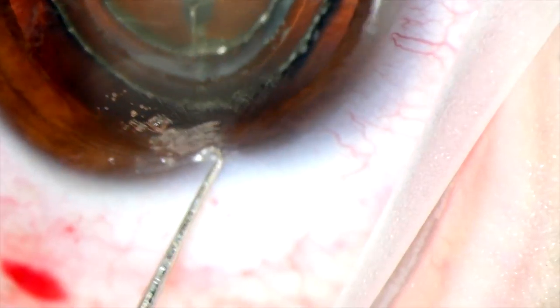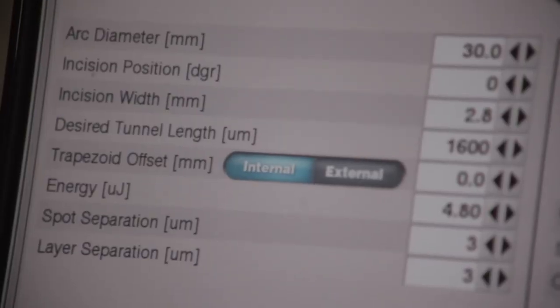The second plane will provide the means and the path toward the anterior chamber. These incisions should not be too long, which would affect surgical manipulation, nor too short, which would affect sealing. We have opted for a length of 1600 microns.